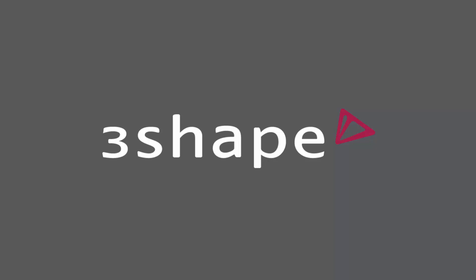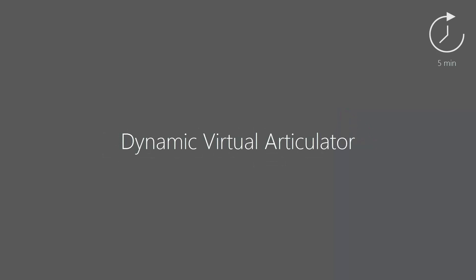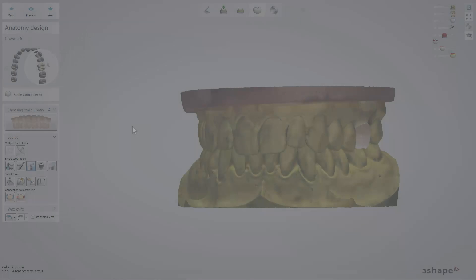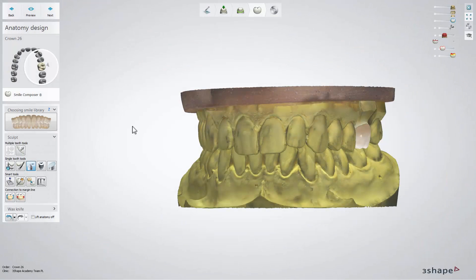Welcome to our video about dynamic virtual articulation. In the design step called Anatomy Design in Dental Designer, you have the possibility to use a dynamic virtual articulator.